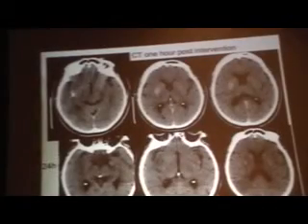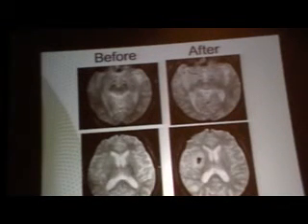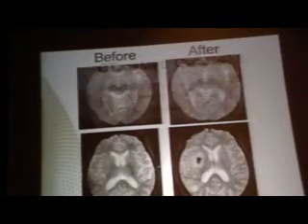And this is after the penumbra. This is the CT scan after intervention. Is this contrast or hemorrhage? Contrast. So yes, it's contrast, but there's also hemorrhage. I'll show you that on the susceptibility. So this is from the procedure, small area of hemorrhage, but overall this patient did fine.